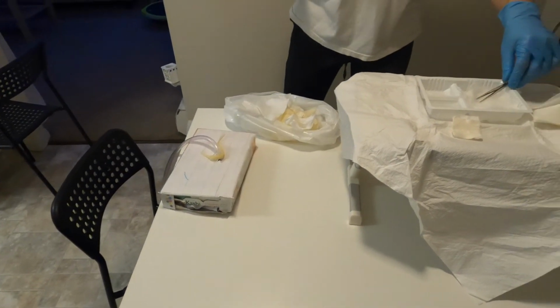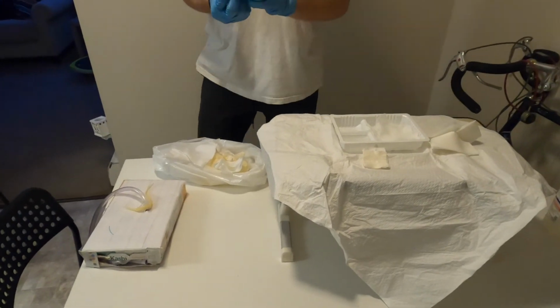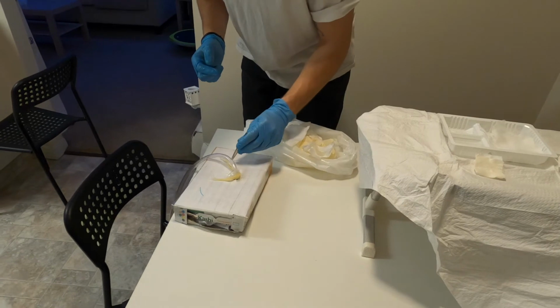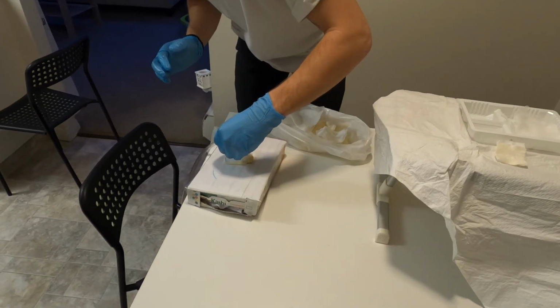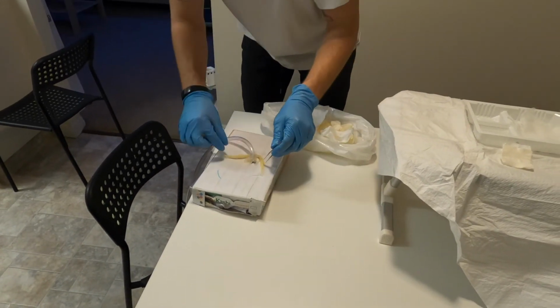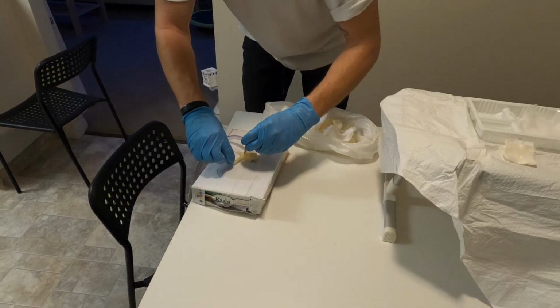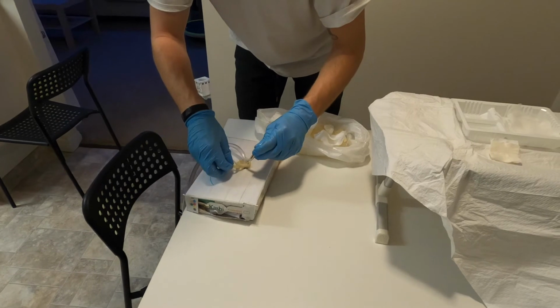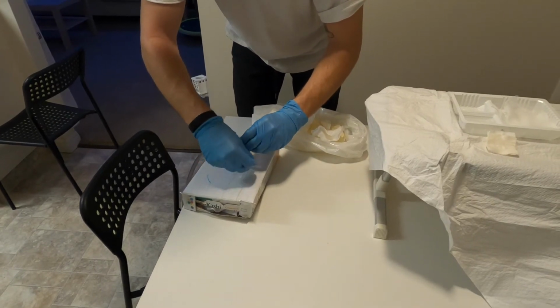I'm just going to grab my forceps here and just tuck this underneath the chest tube and grab it from the other side there. Good.